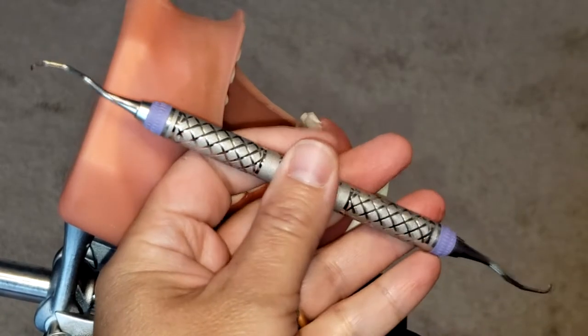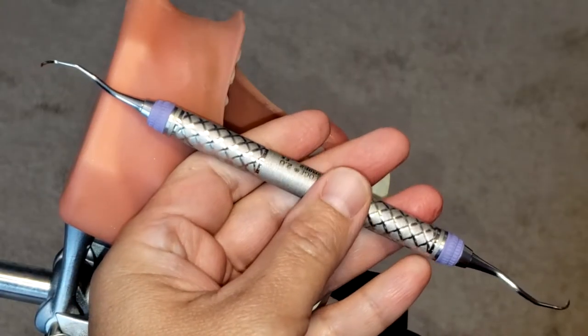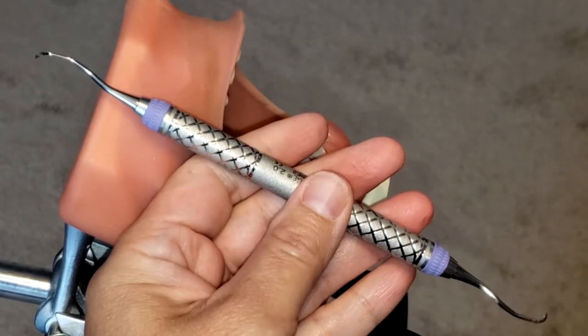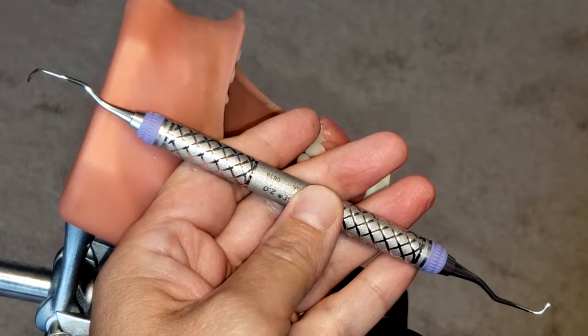Hello everyone and welcome back. Today we are going to be learning how to use the Gracey 1112 curette. This instrument is a great instrument for moderate to heavy calculus removal.